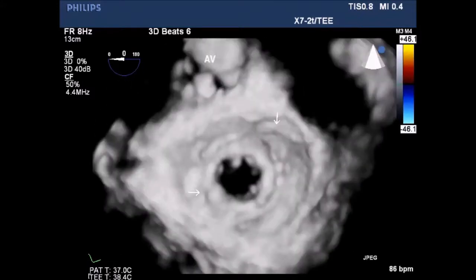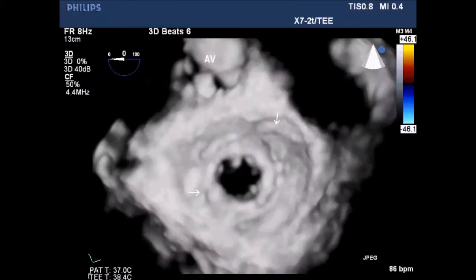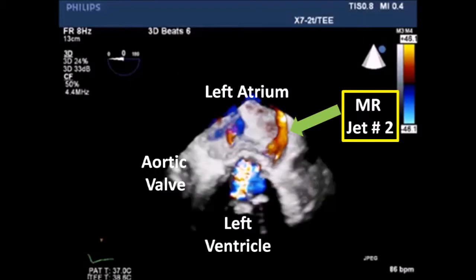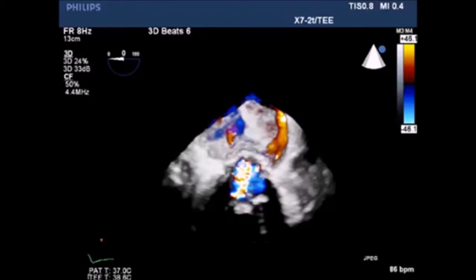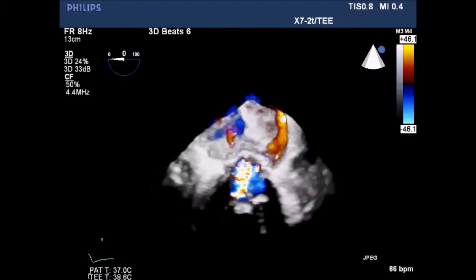A slow-motion image of the mitral valve. Here you can see the two distinct paravalvular leaks of the MR jets. As we continue to rotate the 3D image, you can see MR jet 2 on the right side of the screen and a hint of MR jet 1 on the left side of the screen.